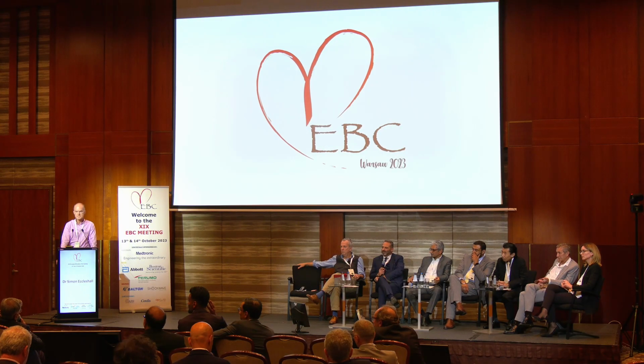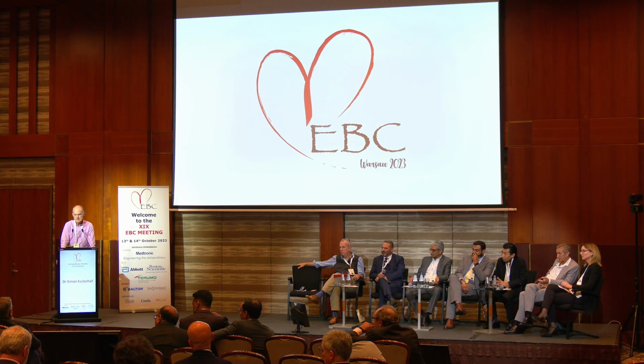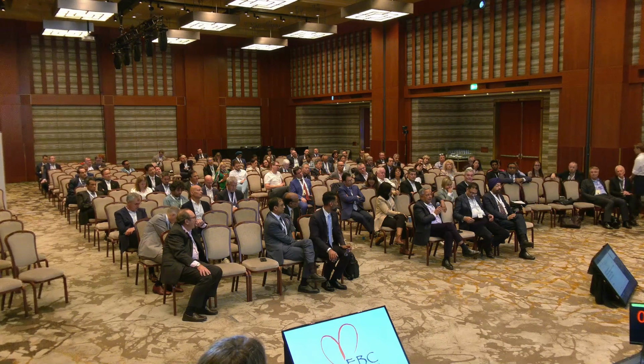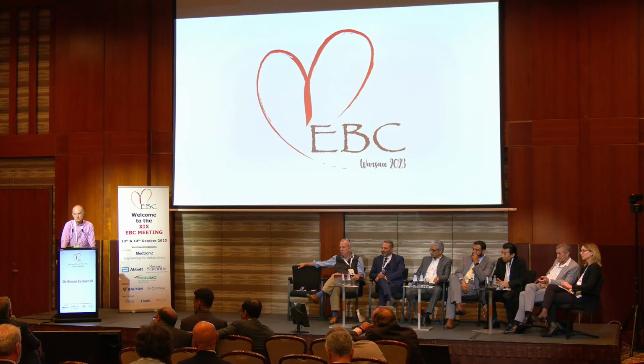So in 1981, Gruentzig did 3 balloon PTCAs of the left main at Emory, 2 of them died. So it's somewhat cavalier just to leave balloon and left main and not stent it. Because there is a risk of sudden death, even though the left main is large. And I think I'd be very wary of doing this without a stenting procedure, even though large stent sizes are available now.